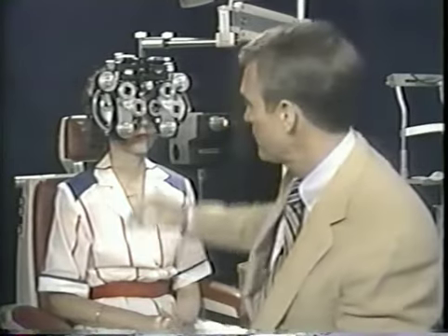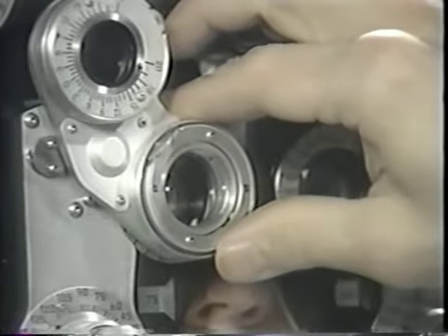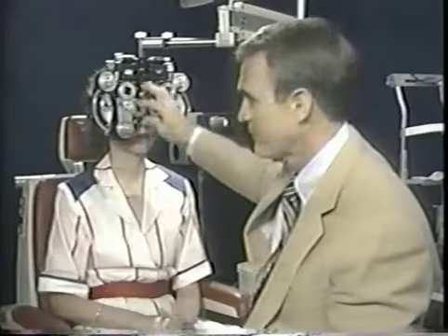Sometimes the patient seems to be leading you in a circle when refining the axis. This happens when the patient keeps choosing the second choice, usually because you have presented the first choice too quickly. If you suspect this is happening, reverse the order of presentation to check for consistency. I do this by asking, which is better, flip 1 or flip 2? If the patient now chooses the second choice, he has contradicted himself and more care must be taken in the testing. Cross-cylinder testing is not foolproof.